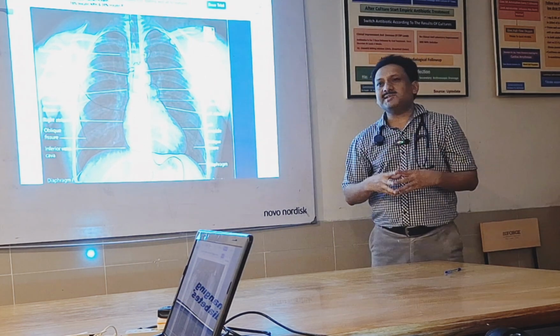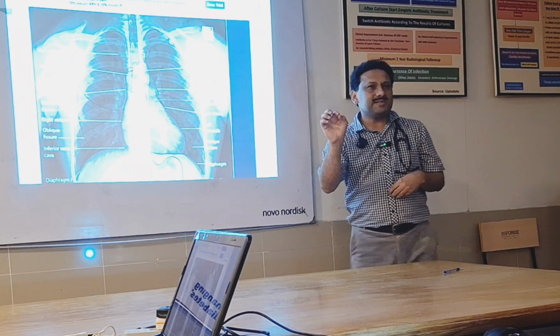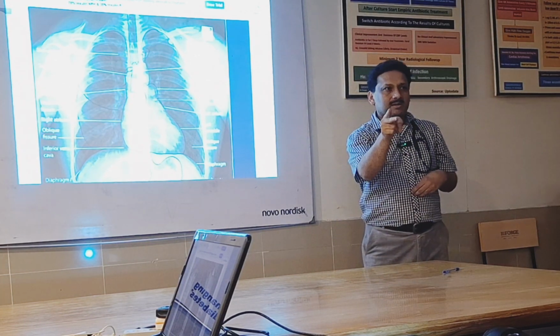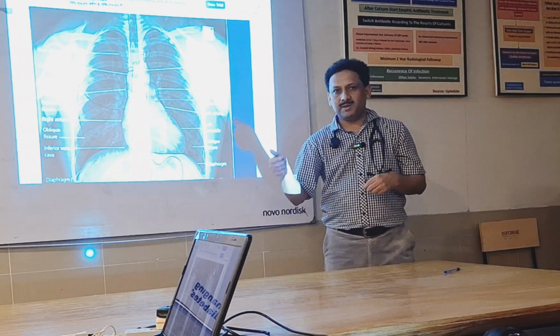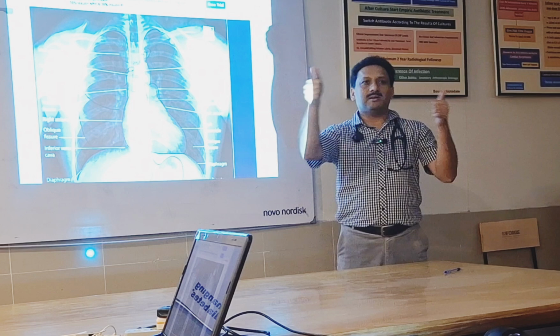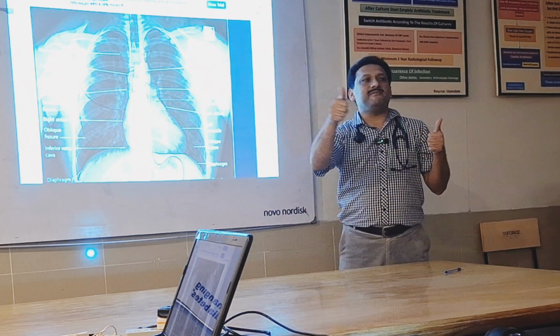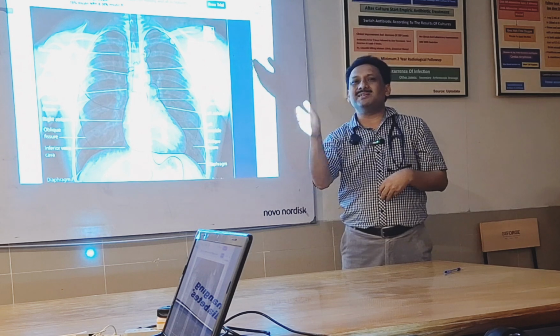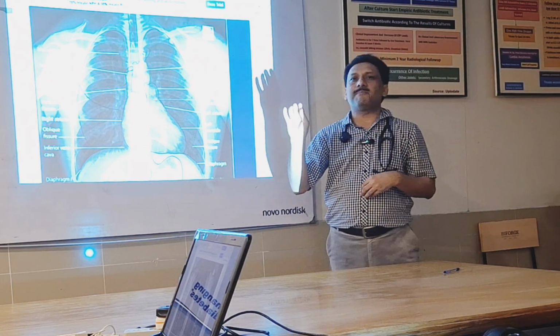Or otherwise, remember a sentence. Please remember easy and valuable ways to describe chest X-ray. So Please for P, Remember for R, Easy for E and Valuable for V. So please remember easy and valuable ways to describe chest X-ray, or remember the mnemonic PREV.